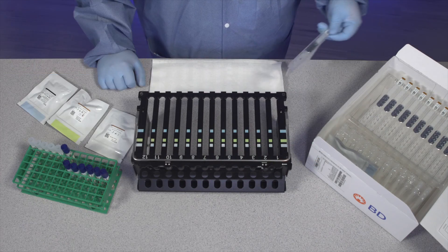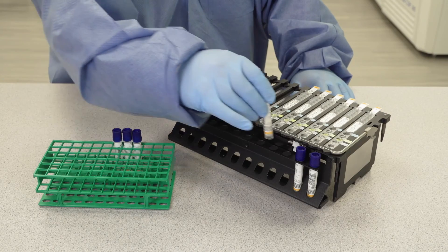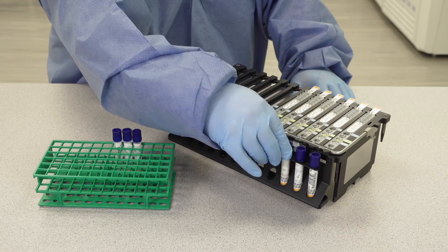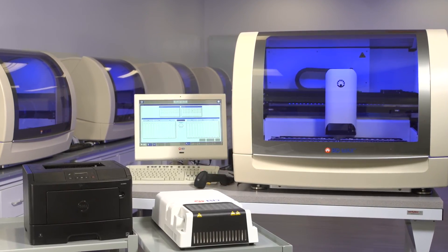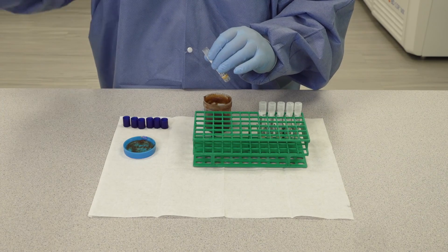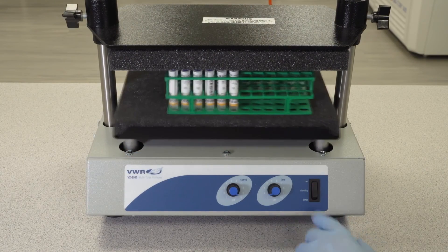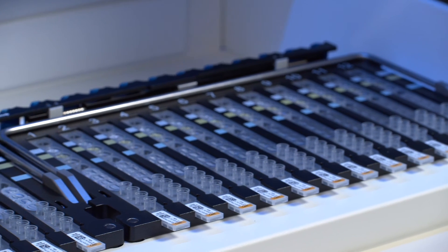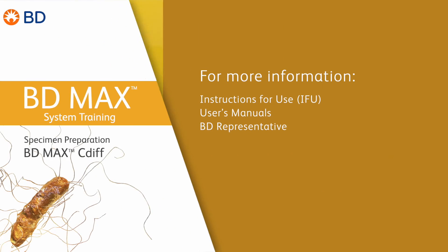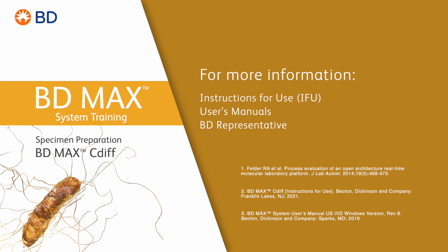Now proceed to the BD MAX system operation section in the assay specific instructions for use to perform testing on the BD MAX system. We hope this program has helped familiarize you with the proper specimen preparation of the BD MAX C. diff assay on the BD MAX system. If you have any additional questions, please consult the instructions for use, user's manual, or your BD representative.